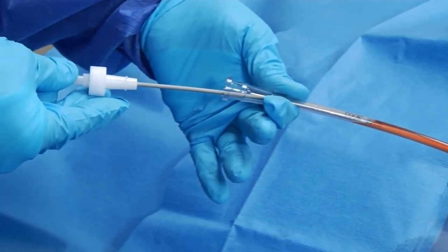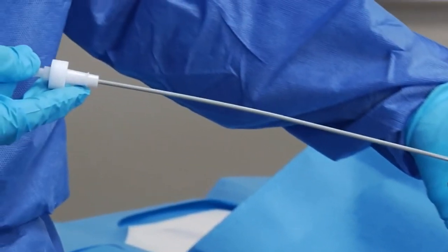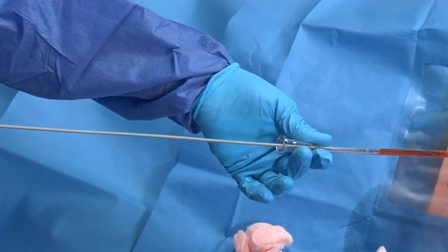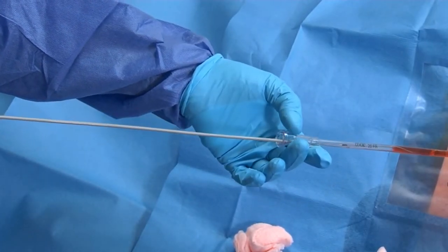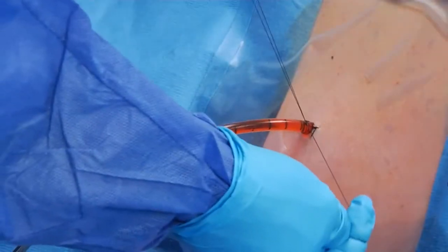Remove the wire guide and chest tube inserter, leaving the chest tube in place. It is important that all side ports of the chest tube are positioned within the pleural space. The chest tube can now be sutured to the skin and is ready for use.